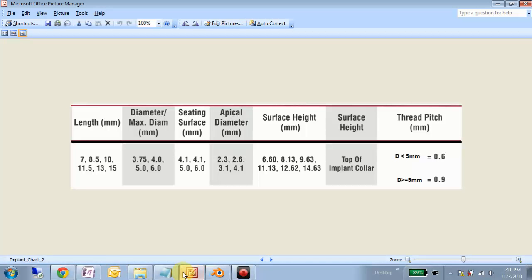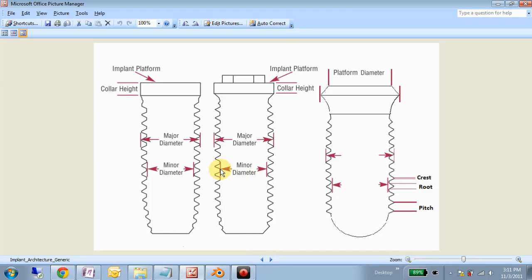So I want to remind you that for this particular example, our thread pitch will be 0.6. We do not know, at least I don't know, the minor diameter. I'm going to make a guess for it. And we also don't know this angle here, or the geometric relationship of these threads. So we will guess a little bit on the thread, but at least the implant pitch, the thread pitch, will be correct.